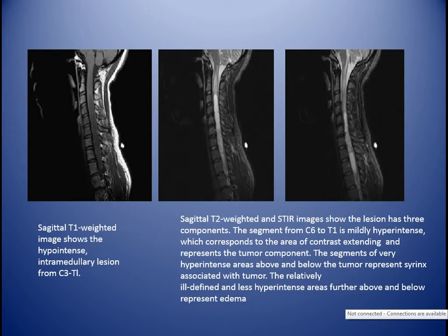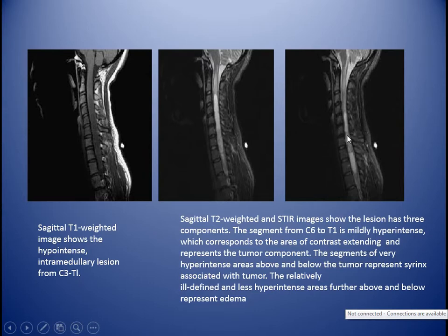The appearance is more complicated because hemorrhage is more common, with cysts and other features. Sagittal T1-weighted image shows a hypointense intramedullary lesion from C3 to T1. On sagittal T2 and STIR images, the lesion has three components: the segment from C6 to T1 is mildly hyperintense, corresponding to the area of contrast enhancement representing the tumor component. The very hyperintense areas above and below represent syrinx, and an ill-defined area represents edema.